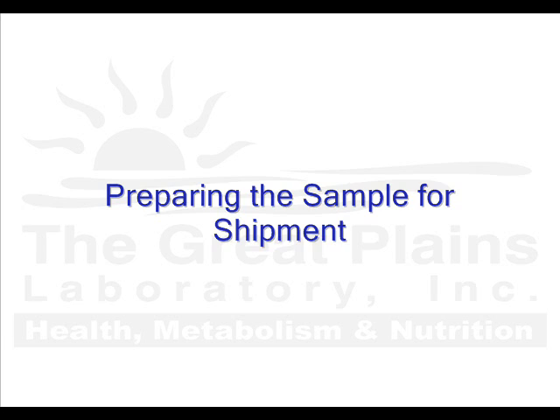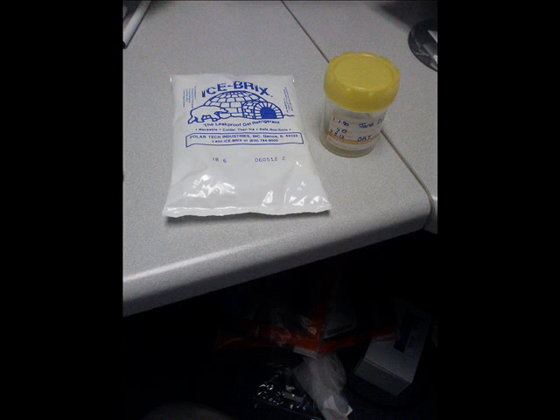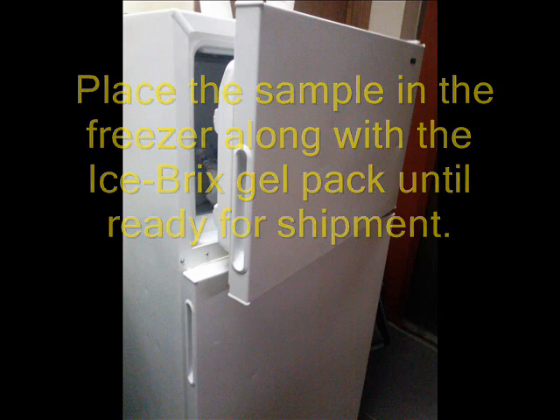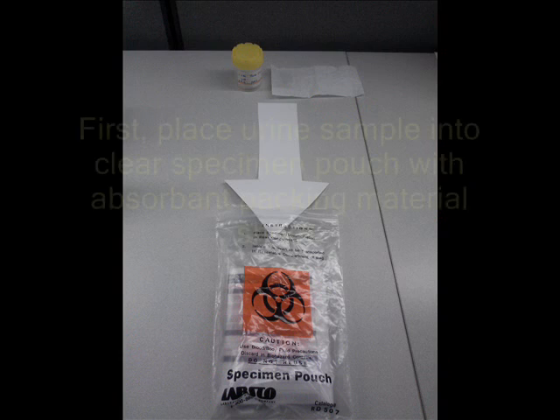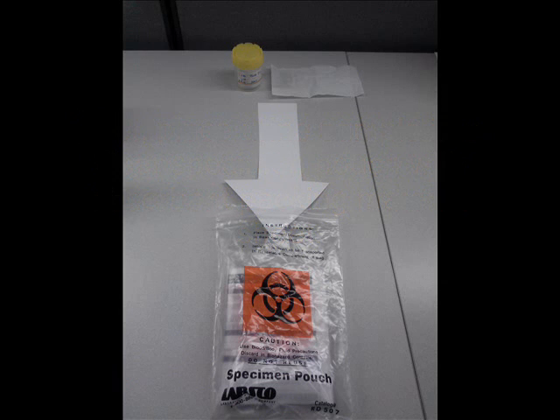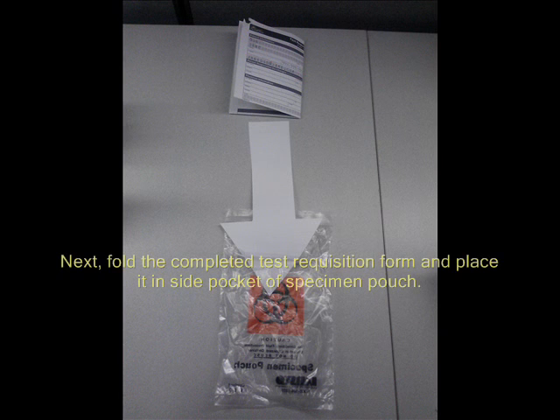After collecting your sample, label the cup with the patient name, collection date, and date of birth. Place the urine sample into the clear specimen pouch, along with the absorbent packing material sheet. Fold the completed test requisition form and other necessary paperwork, and place them in the side pocket of the specimen pouch.